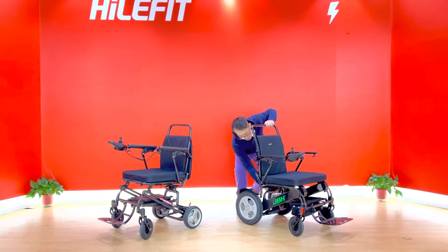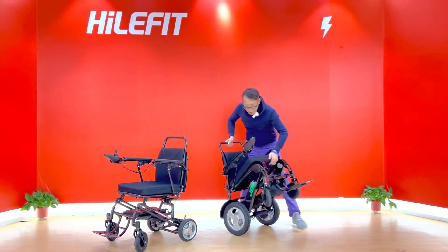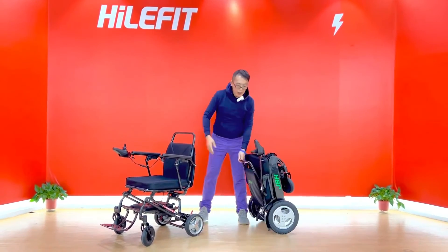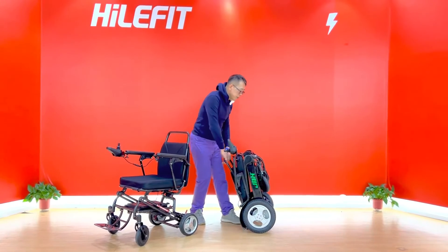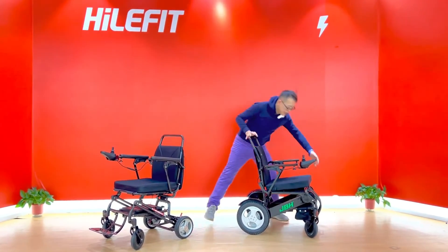This one is also the same type of mechanism — also easy to fold so you can take it everywhere you want to go. Open it — also one second, very simple and easy.